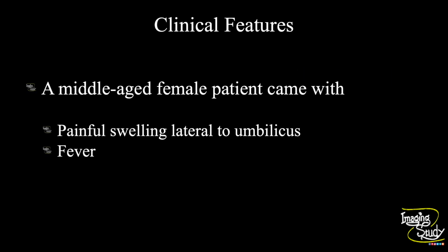Today we are going to see a case of paraumbilical abscess. A middle-aged female patient came with painful swelling lateral to the umbilicus. She also complained of fever for 3 days. Let's see what we have got on ultrasound.